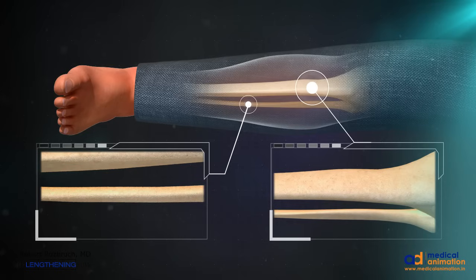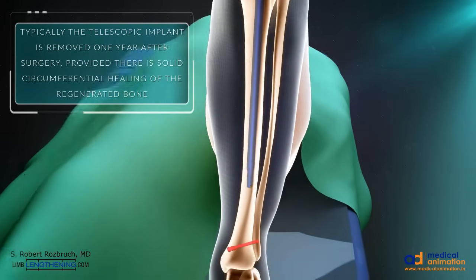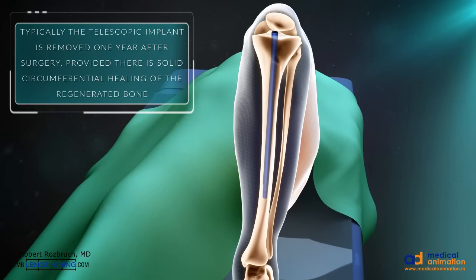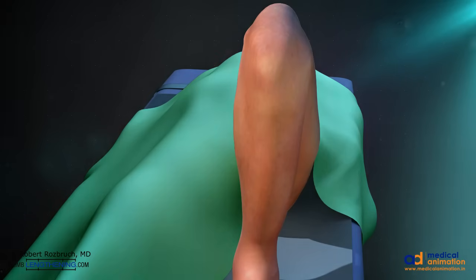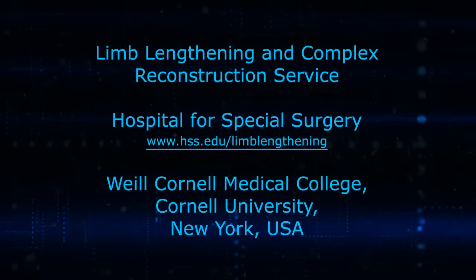Once enough bone healing has been achieved, the patient is fully weight-bearing. We typically remove these implants after about a year. It's an ambulatory surgery where the interlocking screws and the fibula length stabilization screws are removed, and then the intramedullary nail is easily removed through a small incision from the anterior proximal end of the tibia. I hope that this has been an interesting and informative review of tibia lengthening using the telescopic motorized intramedullary nail.